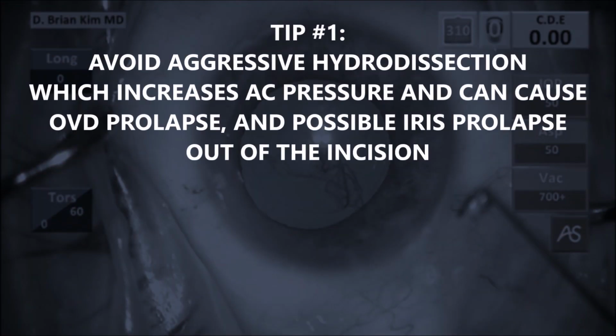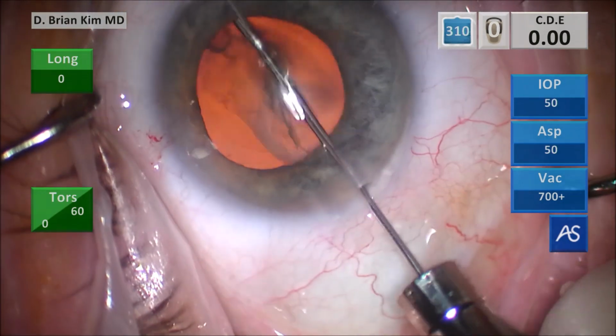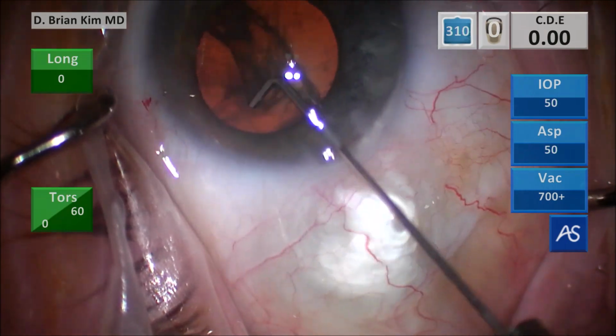Avoid aggressive hydrodissection, because this causes increased anterior chamber pressure, and this can cause the viscoelastic to suddenly prolapse out of the incision, which will then possibly prolapse the iris out of the incision. So this is the capsular fornix hydrodissection technique. I place the cannula under the rhexis edge, I get a nice wave, but you can see I stopped.